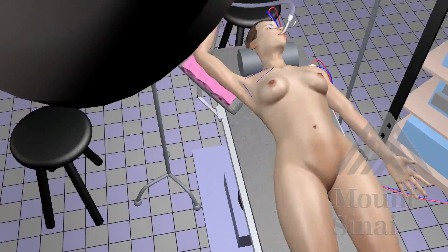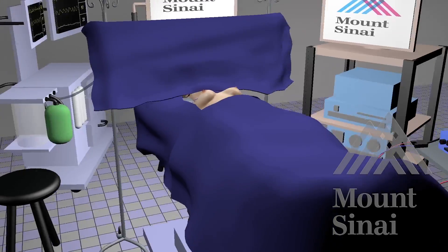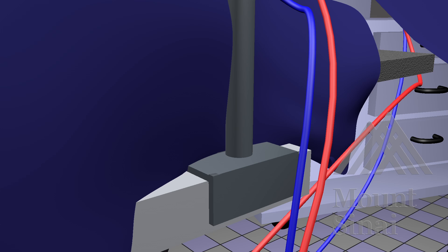Prep and drape the patient in a sterile fashion. The sterile area should extend to the patient's upper abdomen and include the breasts. Next, the base of the external thyroid retractor can be secured to the OR table in preparation for its use later in the case.